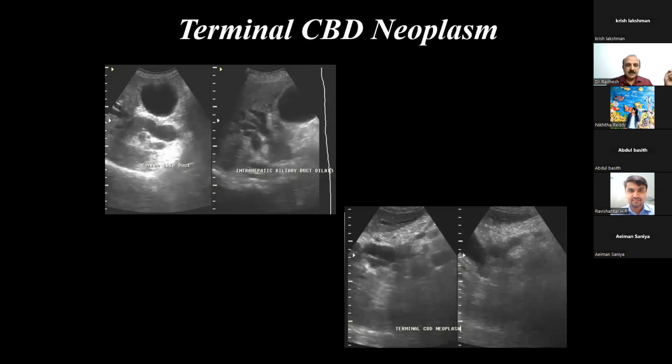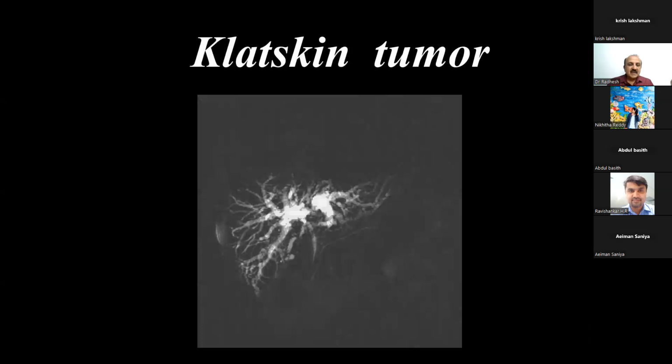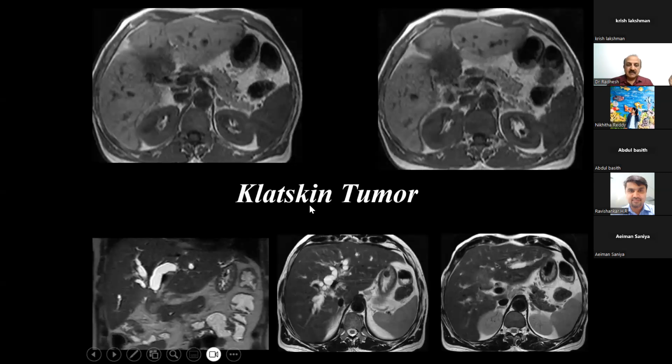Radesh, I presume when we ask for an MRCP as a clinician, you would automatically do the T1 and T2 sequences as well. Yes, sir. We do it, but the only thing is you also need to check, sir. Sometimes what happens is they just do the MRCP and they give these 3D images like this, and we go by what we see here. We just say that yeah, these ducts are infiltrated, but the liver can be infiltrated, sir, and nodes.